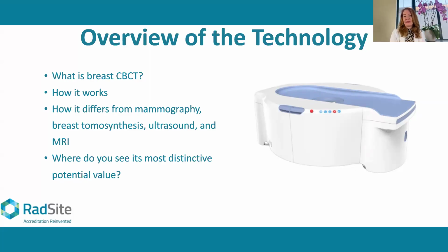Now, I am not a radiologist, I'm just a mere surgeon, but some of the frustrating parts of working with tomosynthesis 3D, this 3D mammogram, which it's not, is when you're seeing the tissue stacked on itself, you can't see through all the tissue. So sometimes you can have what's called summation artifact, where the tissue is just sort of heaped on itself. And from that view, it looks like it might be a solid area or a solid growth. With this true 3D technology, we can see that it's not a solid growth. We can see that it's just tissue that is in that arrangement.